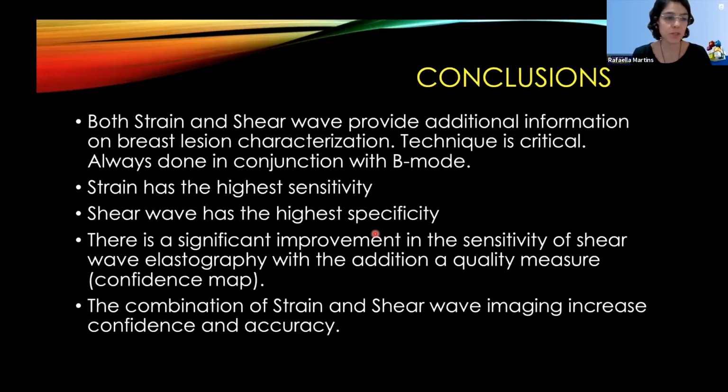So, first question. It's a more generic question. What's the correlation between the shear wave and the point shear wave cutoff values, if there is one? And can you use the same tables?